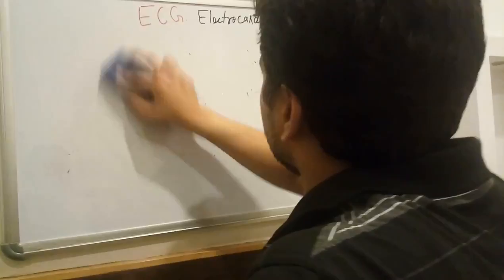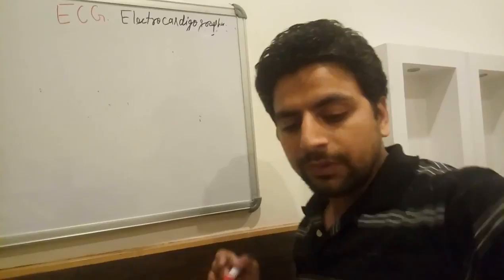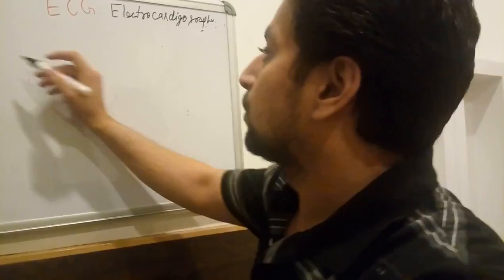Lead number 1, lead number 2, AVL, AVR, V1, V2, V3 on ECG we are going to see. So what was the meaning of these? Like lead number, I am going to explain you. Like we have to know the inferior leads.